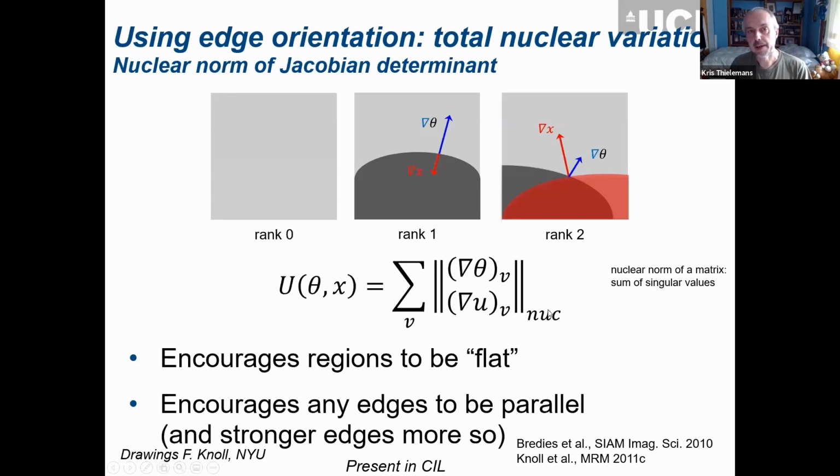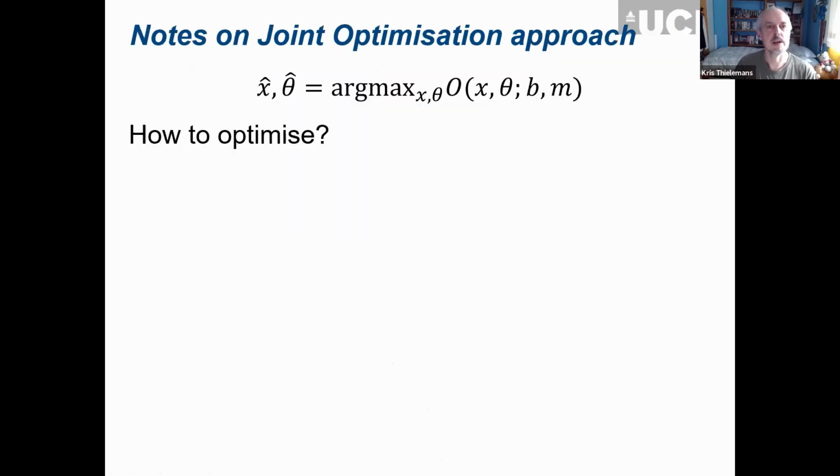However, this prior is convex in both modalities, so it is maybe easier for an optimization algorithm to handle. Okay, so those, I believe, are the two main ones. There are variations on all of these, and you can do things with wavelets or curvelets and so on, but I think these give you the main idea, and these we do have in CIL.